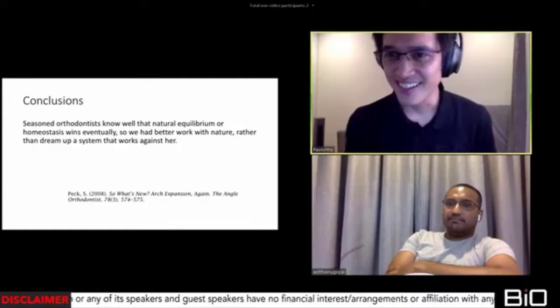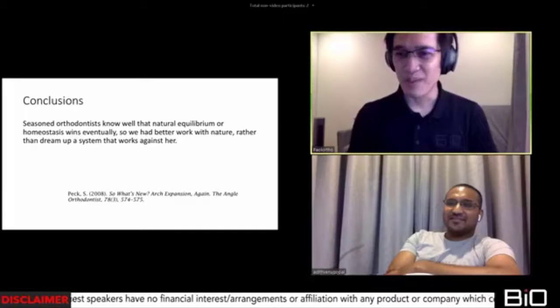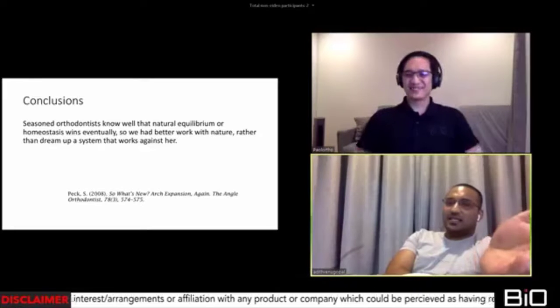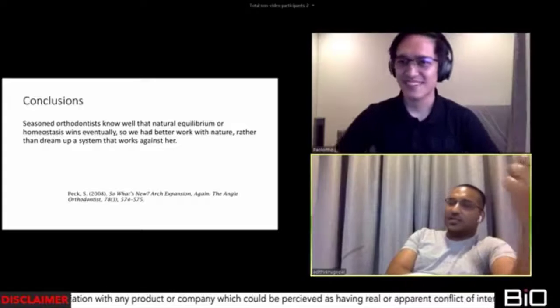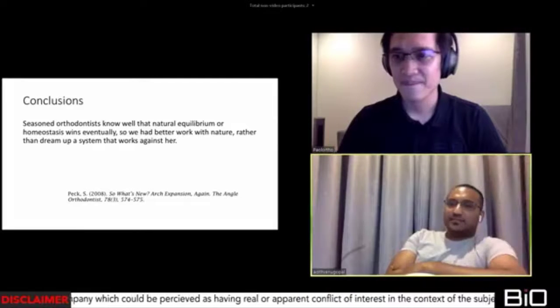These buccal shelf implants are, I don't know, black magic. Oh, they're saviors. You can see that case. I really screwed up the midline, and I had no space on the right side. So you need to get the third molar out, of course, and then yeah, you can just move it.